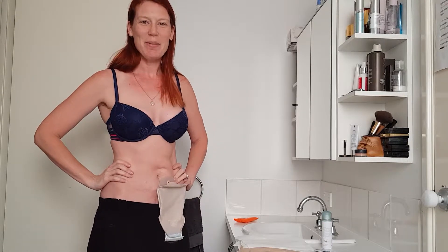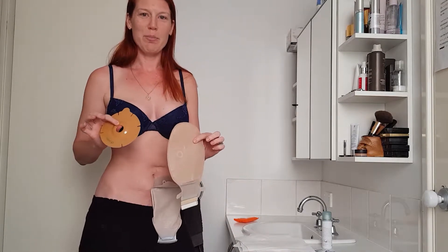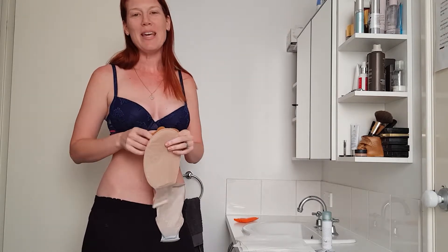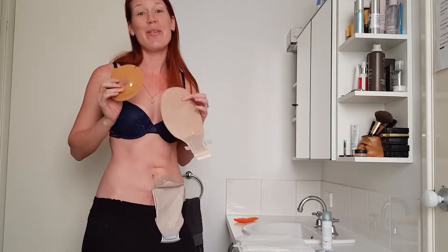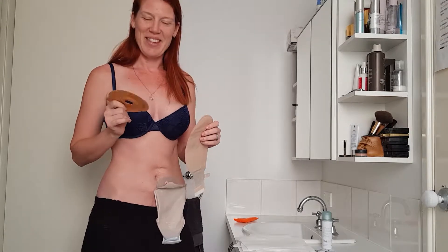Morning everyone, my name is Erin. I'm from Inside Out Ostomy. Today we're going to be trying the Harmony Duo range by Salts. There's been such a huge hype around the Be Confidence by Salts. Unfortunately, they're not available in Australia at this moment, so I thought I'd try the Salts product, the Be Harmony one, and we'd give that a go.